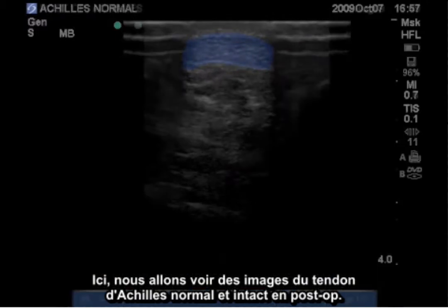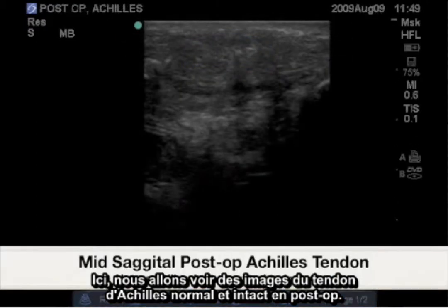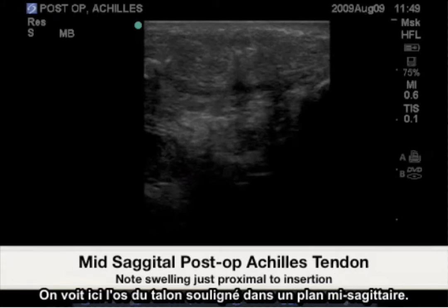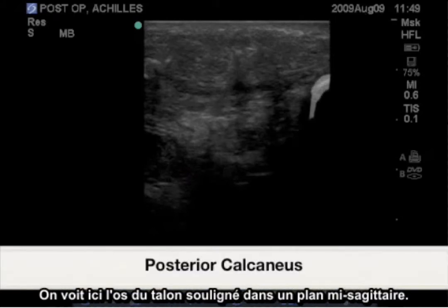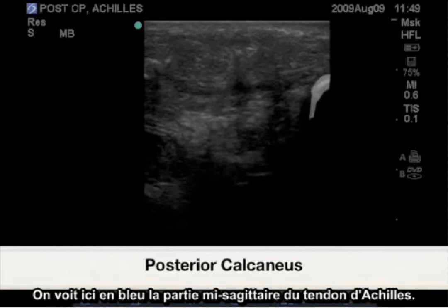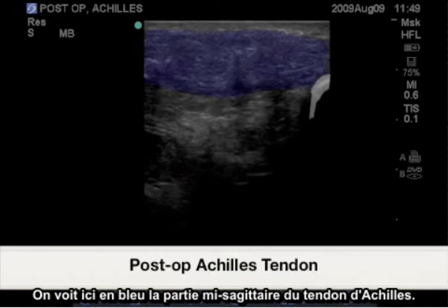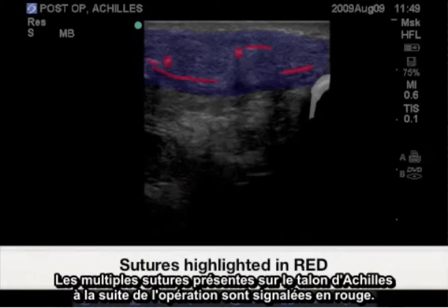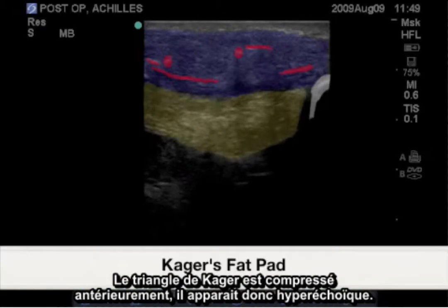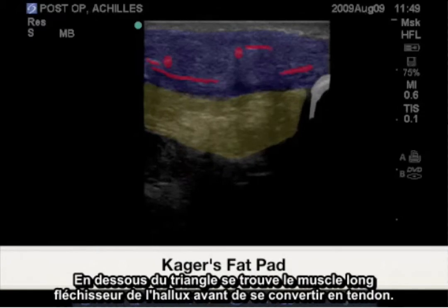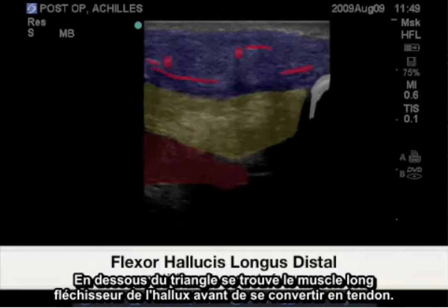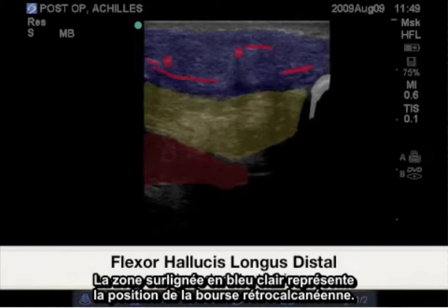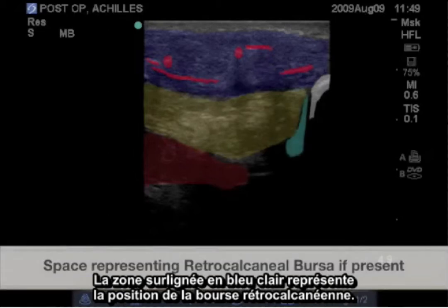Here we will see images of the normal intact post-operative Achilles tendon. Highlighted here is the posterior calcaneus in the mid-sagittal plane, and highlighted in blue is the mid-sagittal Achilles tendon. Highlighted in red are the multiple sutures present throughout this post-operative Achilles tendon. The Kager's fat pad is compressed anteriorly, making it appear hyperechoic. Deep to the fat pad is the flexor hallucis longus muscle before it becomes tendon. The light blue highlighted area represents where we would find a retrocalcaneal bursa.